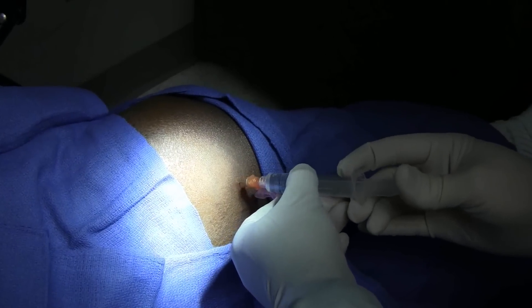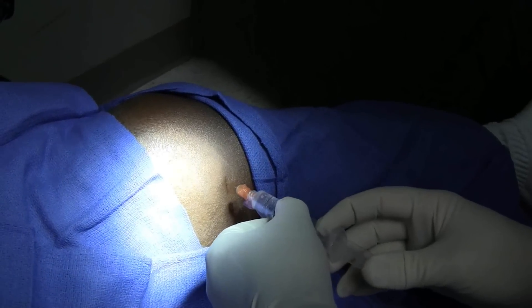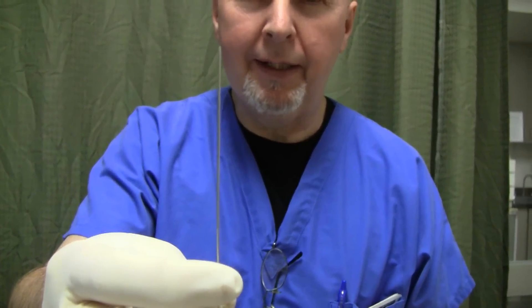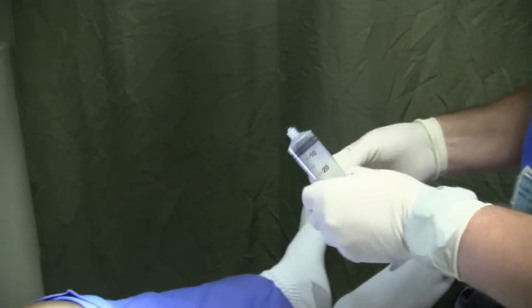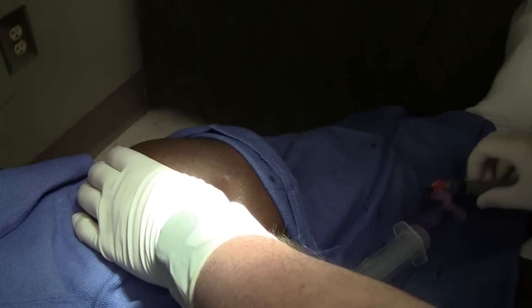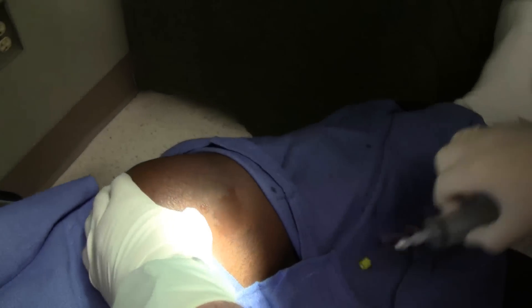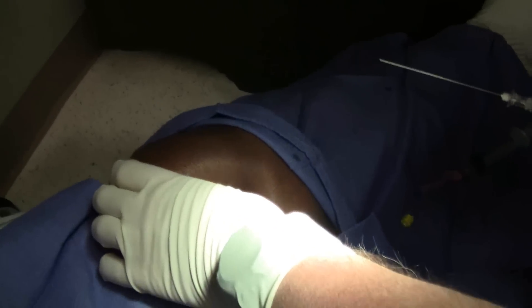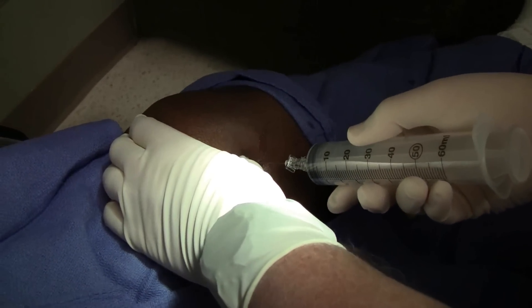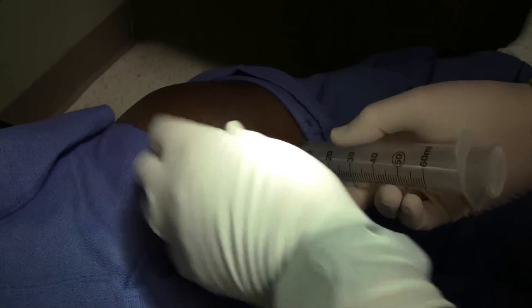Giving myself a big field here — is that hurting you too bad? Okay. So we're going to use a spinal needle because of the degree of swelling, so hopefully this will reach in there and we won't have any false negatives. We're going to bend the knee just a little bit and take the needle right in here.